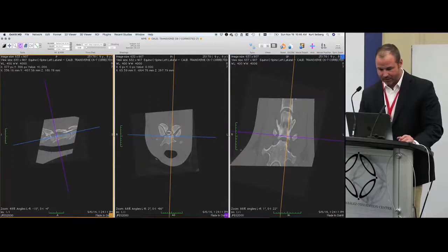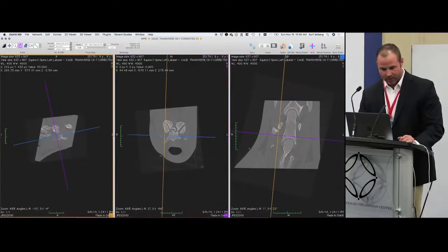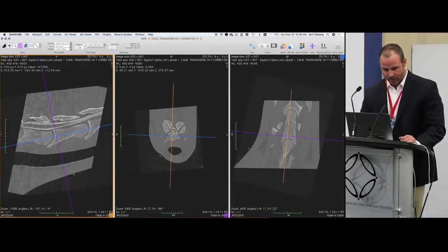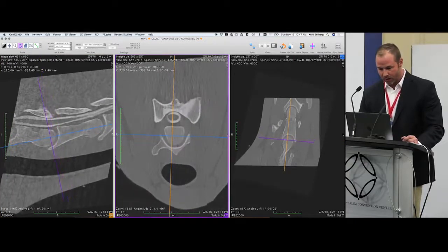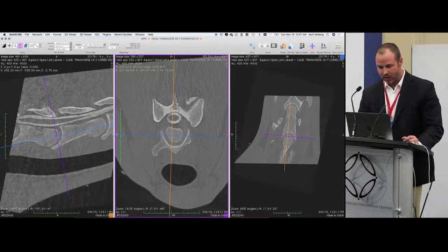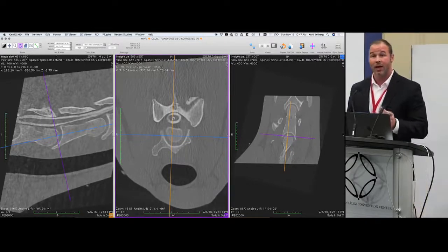So as we look at this specific neck right here, you can see we're in the caudal cervical spine. C6 is coming down, a large kind of plate of bone along the lateral aspect. And as we look at the contrast, specifically as we look at the transverse images, we follow the subarachnoid space sitting right here. As we start to come right over the top of the more normal area right here, a large subarachnoid space, moving down into a more narrowed subarachnoid space, you can see the percent area of the subarachnoid space versus the spinal cord narrows a fair amount. And we're learning more and more about what is happening at this particular area.